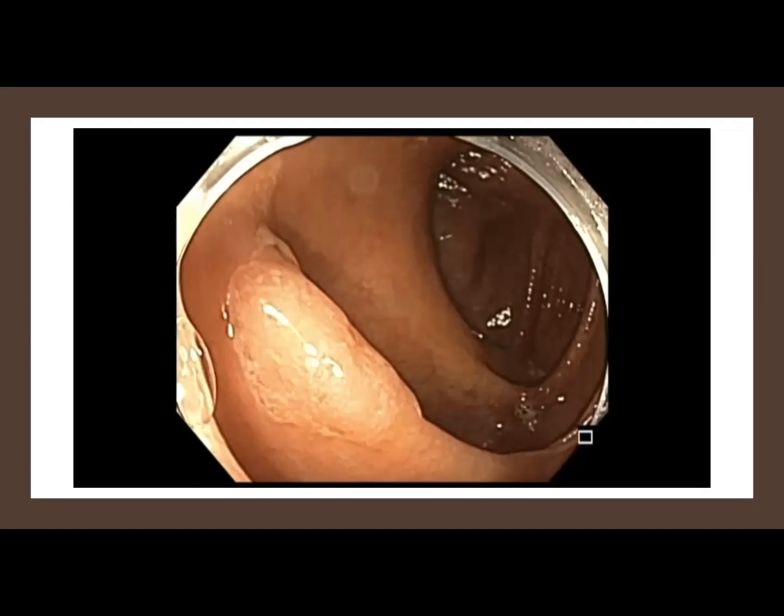That area becomes tethered to the wall. The other point, which Roy commented on, is whether there is dysplasia or not. It is very important to keep in mind, once you wash off the mucus, to look for whether there is an SSA plus an adenomatous component, like tubular adenoma or tubulovillous adenoma-like features. In that case, I urge you not to use your cold snare.